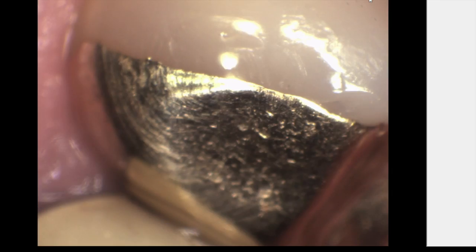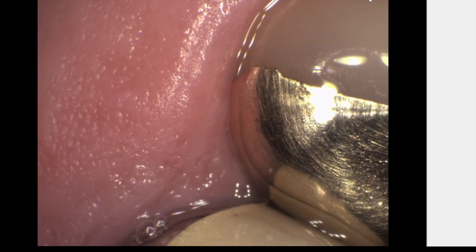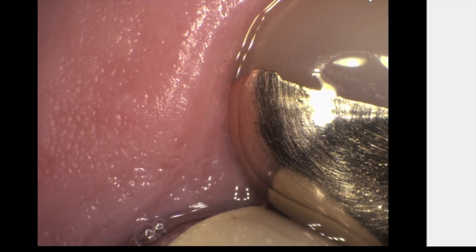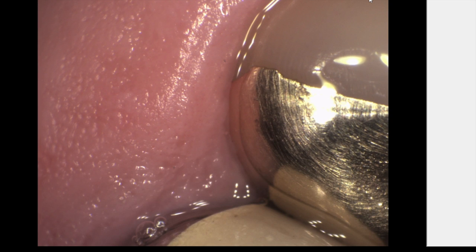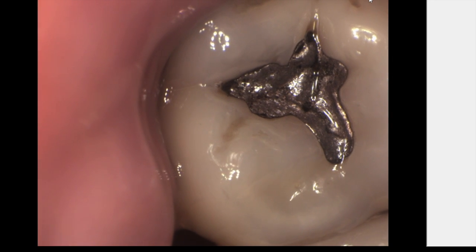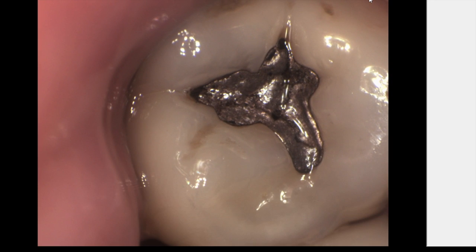You can use the x80 with or without a camera cover, however there are three good reasons to use a camera cover. One: patients like the one-off disposable surface. Two: they'll never taste disinfectant or cleaning products.